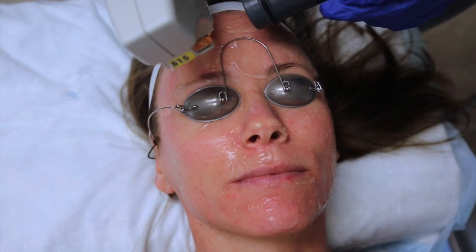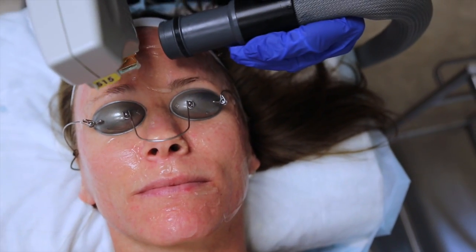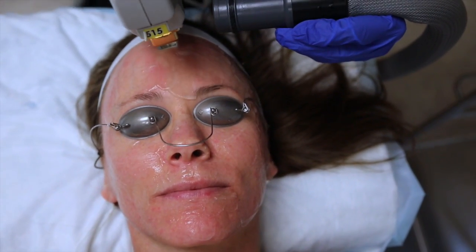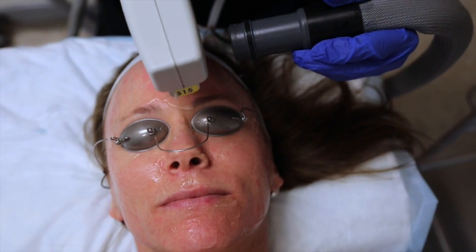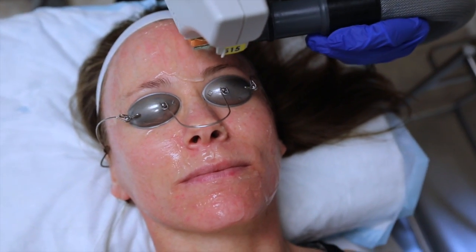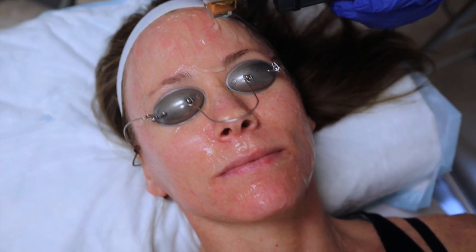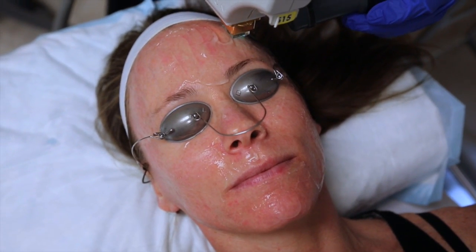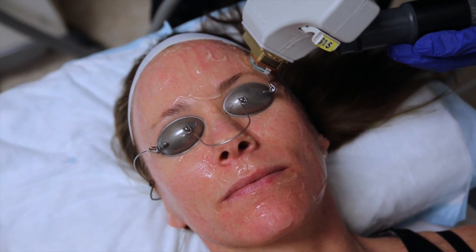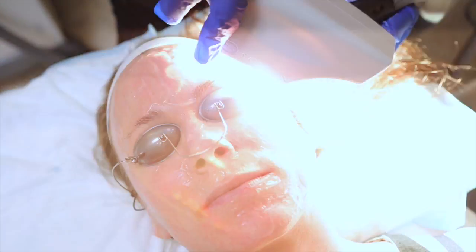So the other terms that have been used for this treatment are intense pulse light treatments, or photofacials, or IPL. We call it a BBL because the company has trademarked that term for this particular laser. And photofacial is actually a trademark procedure invented by a Dr. Bittner in California. So I'm actually doing a photofacial procedure. Having been taught by Dr. Bittner personally, I'm allowed to use that term.